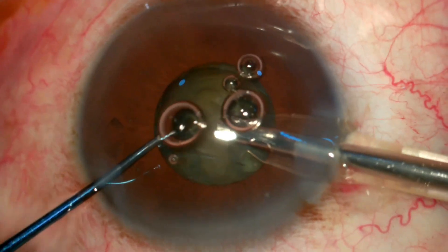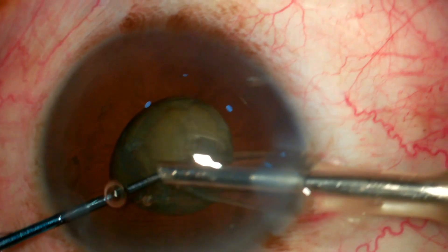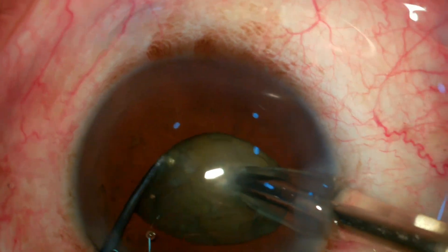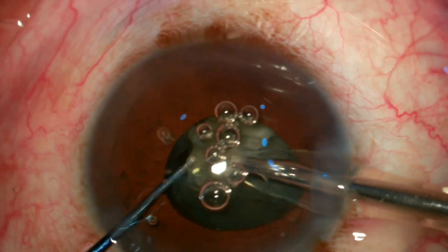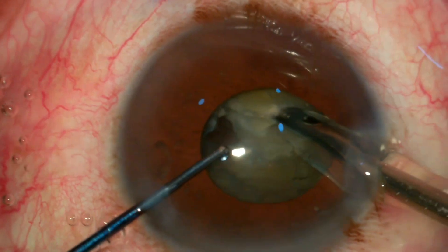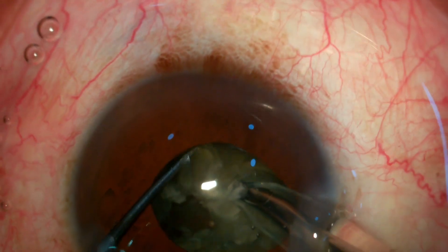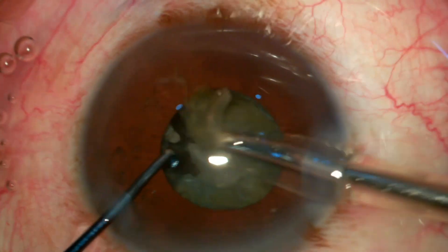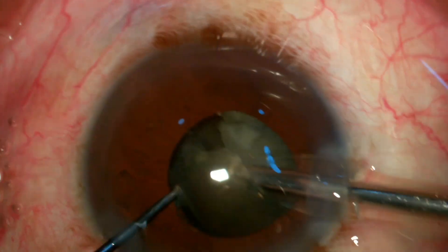Now it's time for phacoemulsification. I'm burying my phaco tip into the nucleus and at the same time moving my chopper to the periphery and cracking the nucleus. After getting the initial crack, I'm going for another crack and separating a small pie of the nucleus — the idea is to create space so I can rotate the nucleus easily and decrease the bulk of the nucleus.